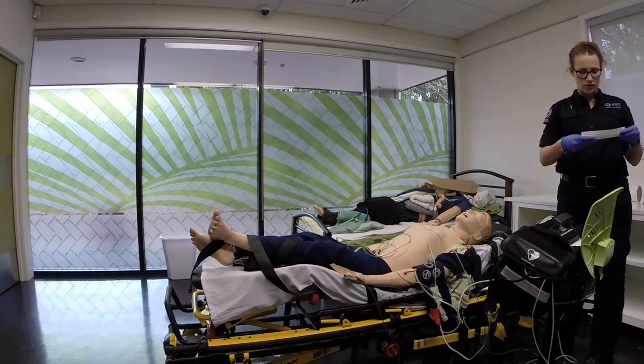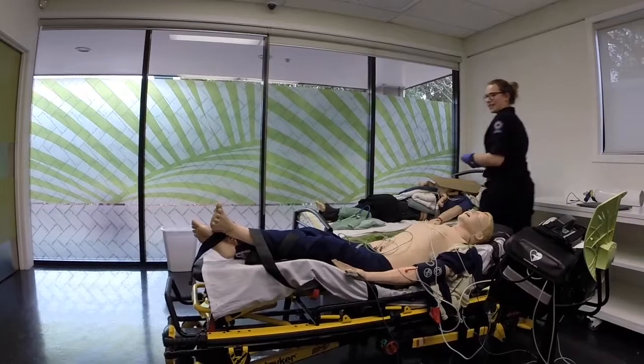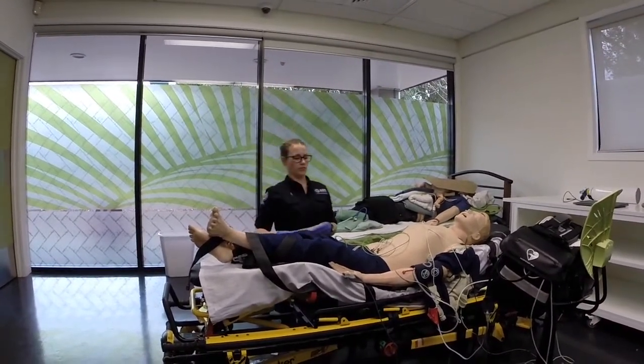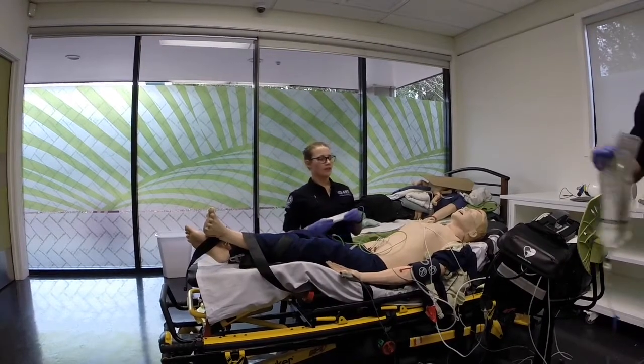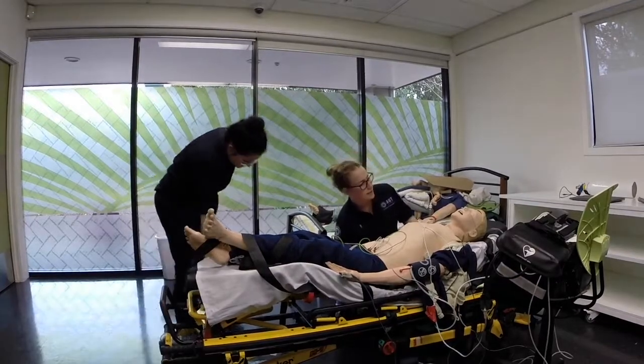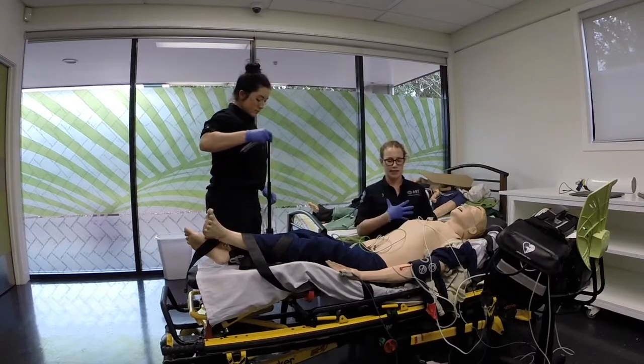Cool, so his 3 leads shows that he is now in normal sinus rhythm with a rate of 80. Yeah, so reassessing airway, breathing, circulation, his airway is still patent, still clear. His work of breathing is still there, however it seems like it's less.